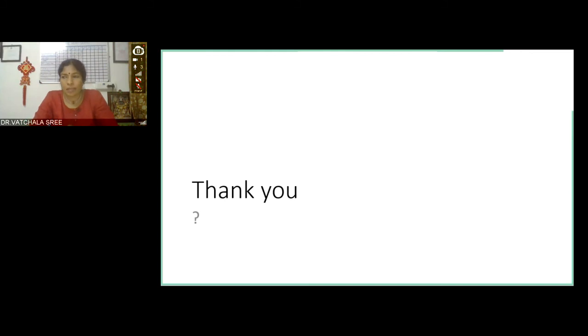Thank you so much. That is a complicated question, but as I'm hearing it, I'm thinking it through. You made a very valuable point. Global longitudinal strain and EF do and do not correlate. By and large, when the EF is less, the global longitudinal strain is also less, but you can have a normal EF and an abnormal global longitudinal strain, as you mentioned. Not only in left ventricular hypertrophy, this can happen in other problems also. Even without left ventricular hypertrophy, if somebody is developing diastolic dysfunction, the earliest abnormality is an abnormal global longitudinal strain.